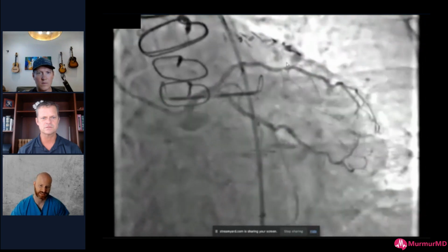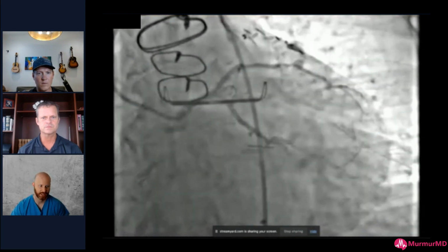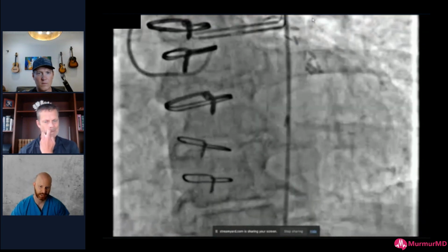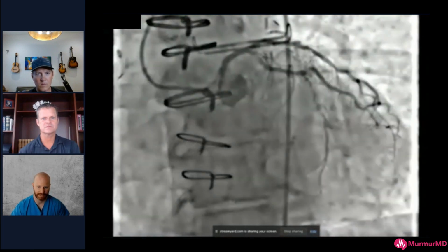There's also a previous stent here that somebody else has ballooned, but never really modified the plaque or the calcium. And so we took some pictures here. You can kind of see it a little better here, but still behind the clip. And then you can, of course, see the bypassed LAD.